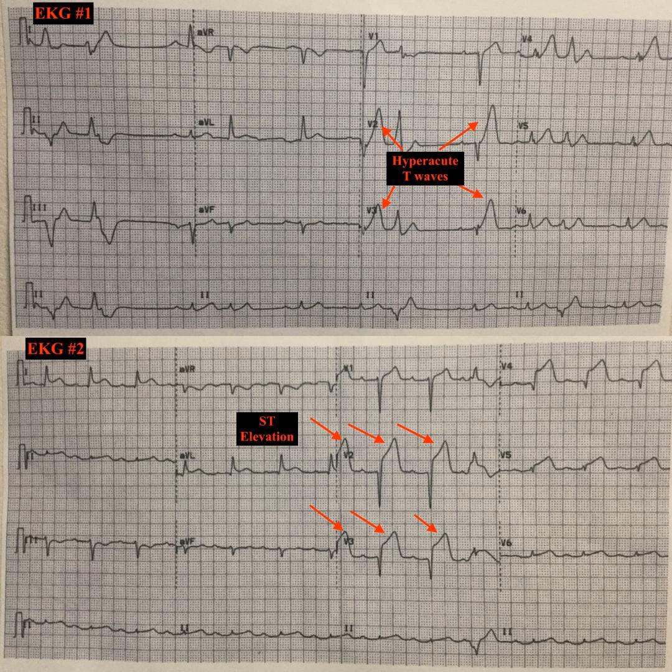Specifically, maybe if you focus on leads V2 and V3, if you have these intrinsic rhythms with the P wave, the QRS complex, and the T wave. T wave? Yeah, peaked T wave, exactly. So as far as the differential diagnosis of peaked T waves, the most common reason we would see a peaked T wave would be hyperkalemia. The second most common would be what these are, which is hyperacute T waves. The distinction from peaked T waves of hyperkalemia is that those tend to be more spiked. This would be considered less spiked and a bit more broad-based.